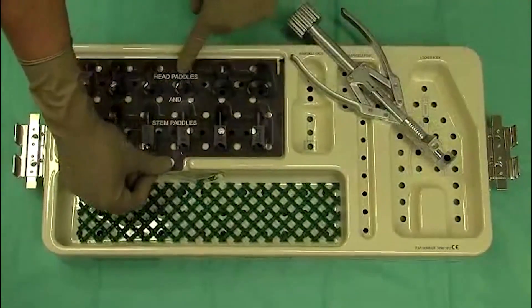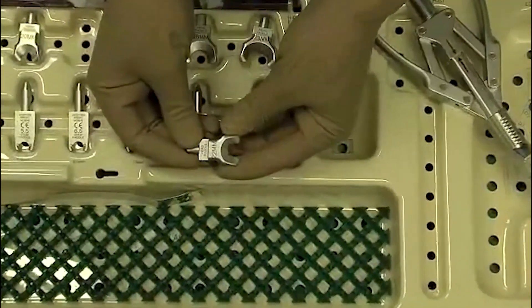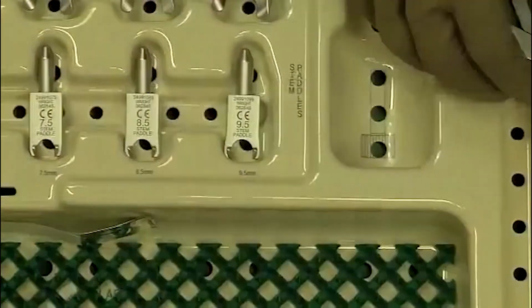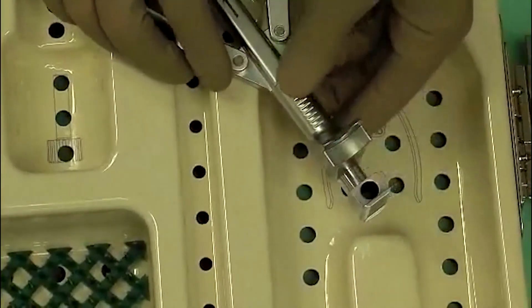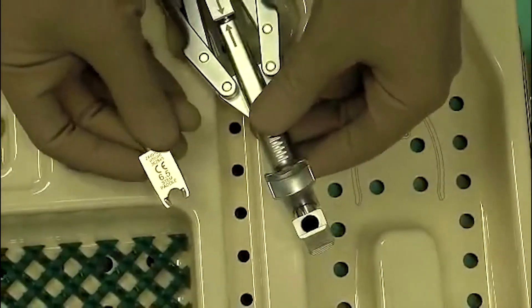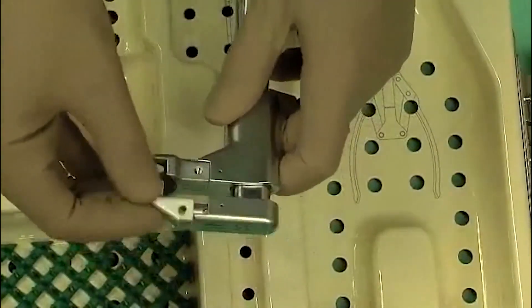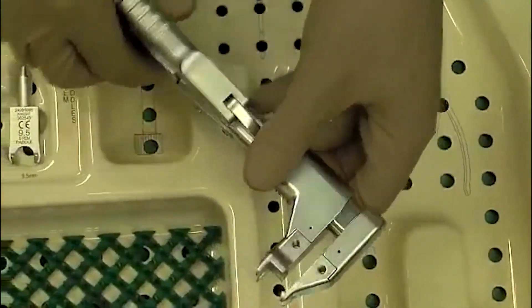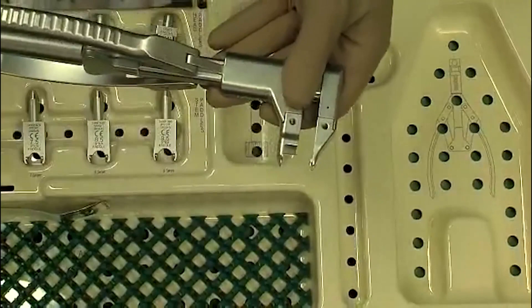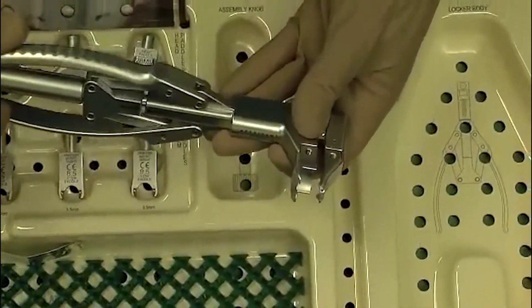For this, we have to use head paddles and stem paddles. Once the size of the implant is selected — for example, a 22-millimeter radial head implant — we would use the 22-millimeter head paddle, which simply slides on to the locker. Then we choose the size of stem, for example a 6.5-millimeter, and that simply goes on to the locker as well. We can then slide this locker into the elbow, over the stem and head, tighten it, and then by squeezing the handles, that compresses the Morse taper.